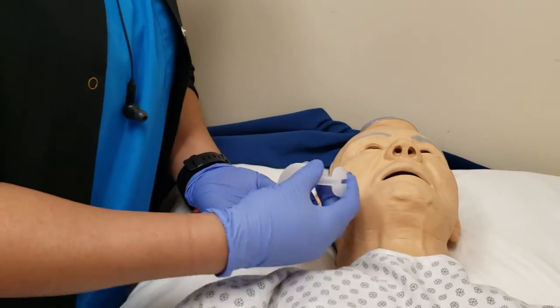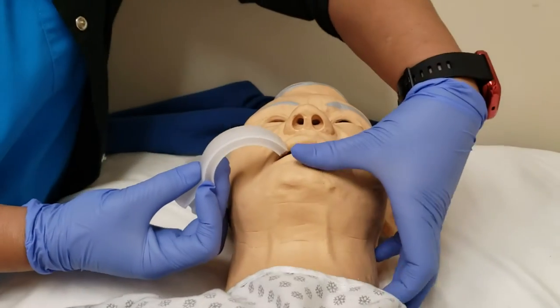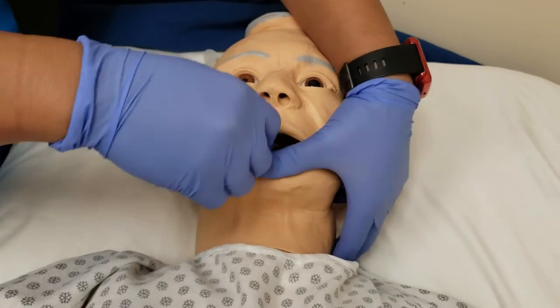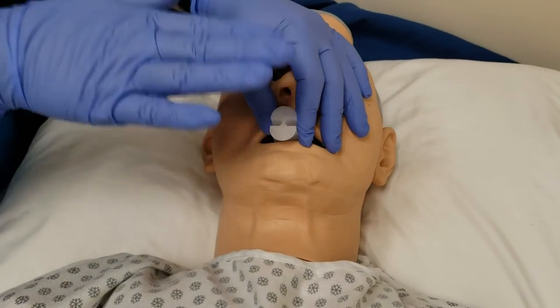How you use it is: take this, go to the side, and you can pull on the patient's chin here. Pull to the side, and as you're inserting, you twist. The idea is to sweep the tongue out of the way. And this should go flush.